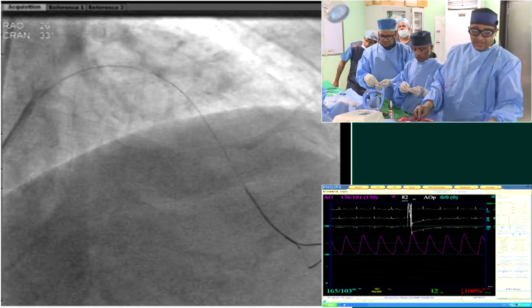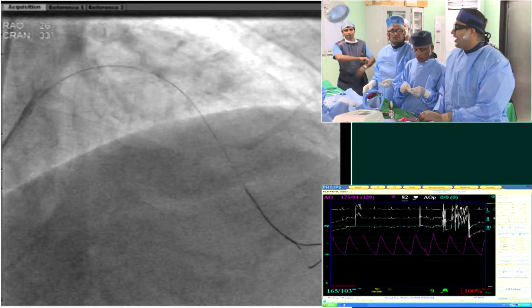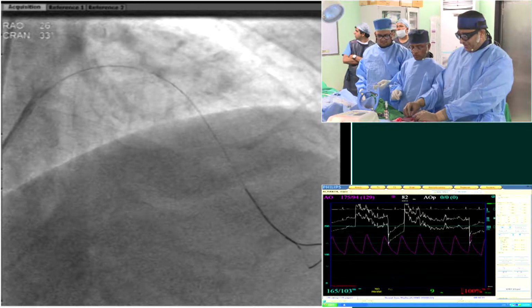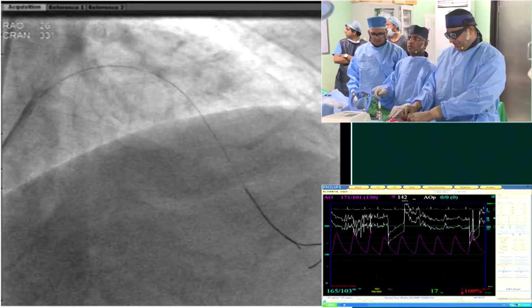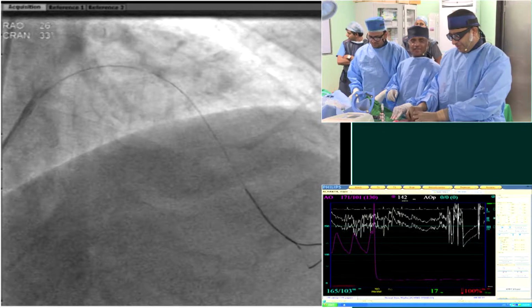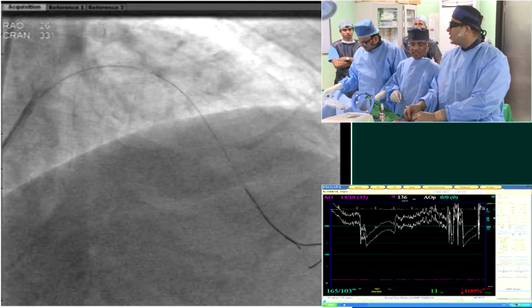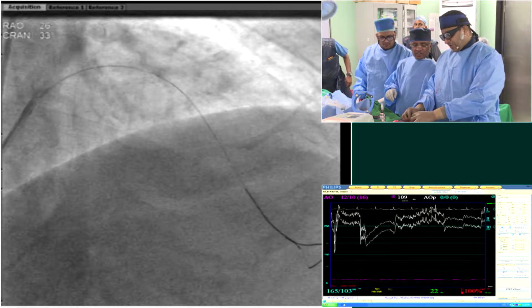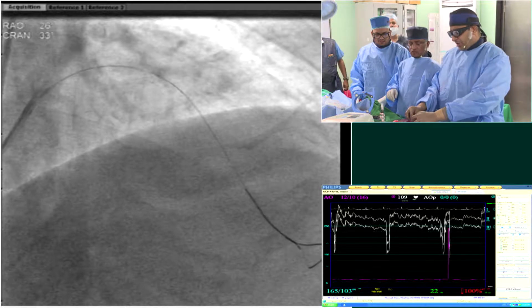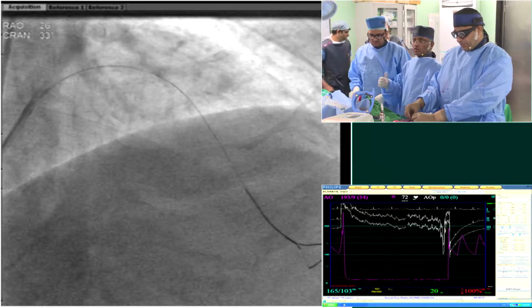What's the opinion of the panel there? Dr. Allen? I think Dr. Yadav is also there. So I guess I run into this situation when I'm doing peripheral vascular work, but as a cardiologist, when do you say enough is enough? Because what you don't want to do is jeopardize that distal LAD, which I maybe have already some concerns about. I think if we can't manage this, we are at a point that it's probably better to proceed at this time.